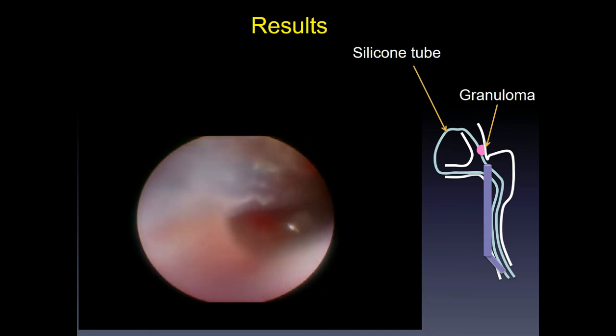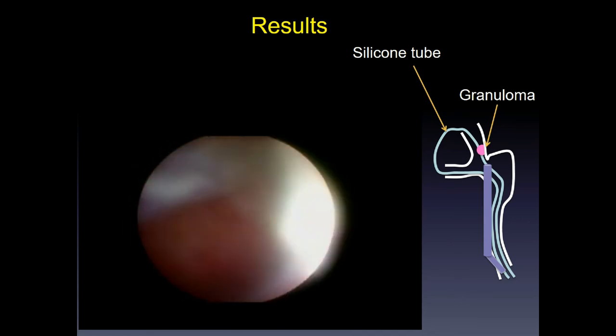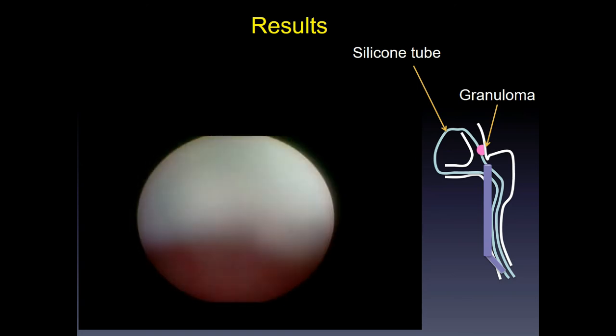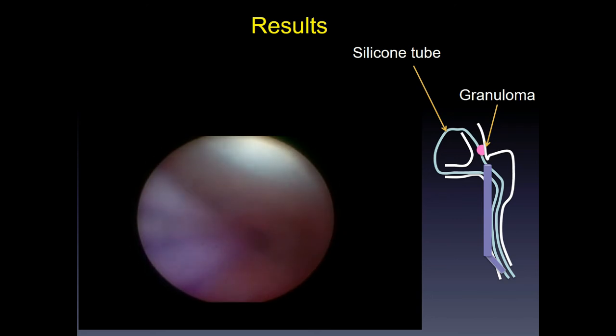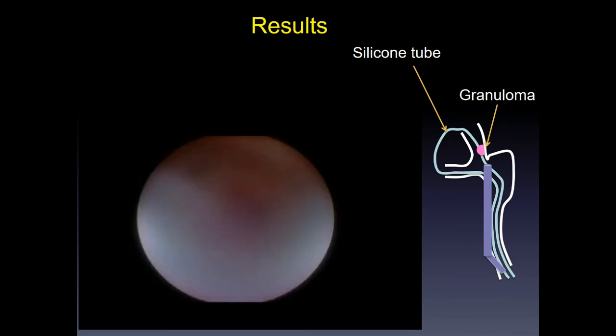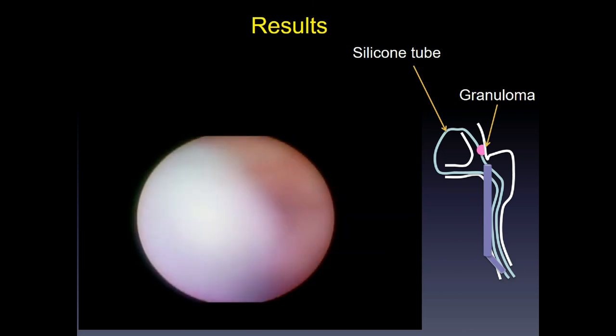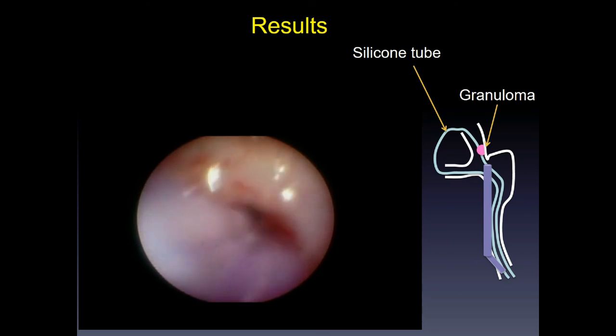Common canaliculus, passing through the mucus, and arriving at the inferior part of the nasolacrimal duct. We can see many capillaries in the mucosa.